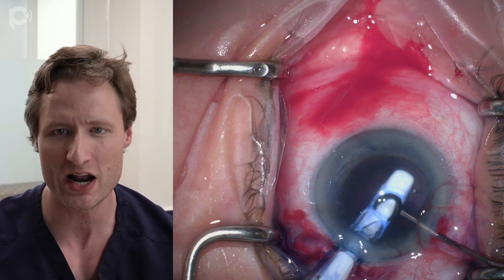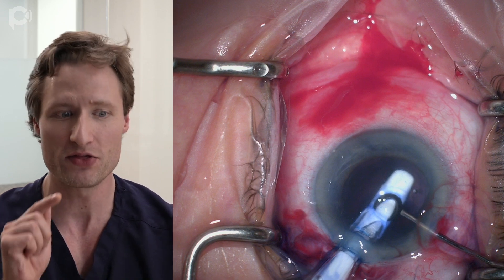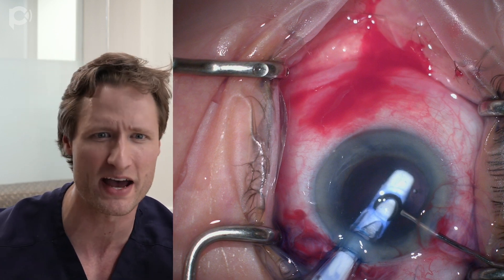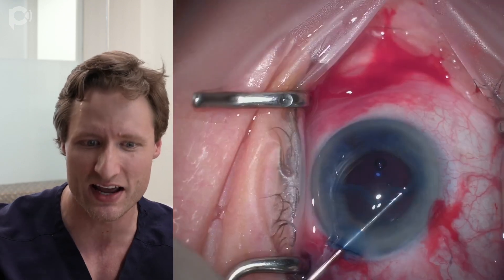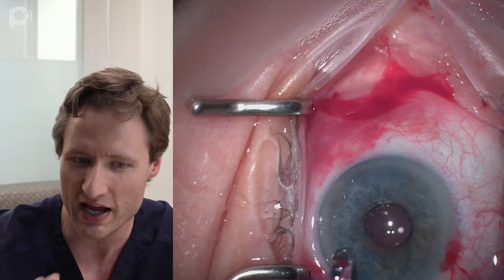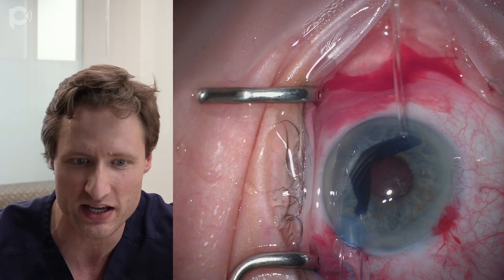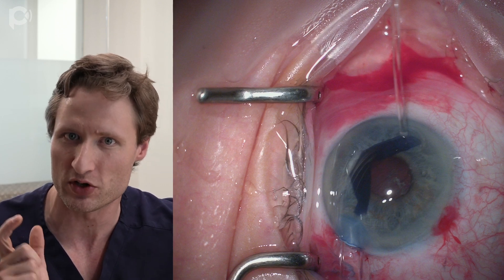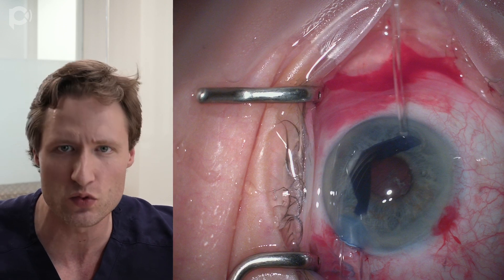No matter what lens I'm using, I put it in the eye before I strip Descemet's membrane. The reason is that whenever you do anything at this stage the pupil comes down a little bit, so if you strip Descemet's first and then go to place the lens, you sometimes can't tell if the lens is in the capsular bag, in the sulcus, or halfway between. I always put the lens in first, then replenish viscoelastic. When injecting the graft, I always aim away from the pupillary aperture — into the angle — so the graft won't fire through the pupil or wrap around the lens.